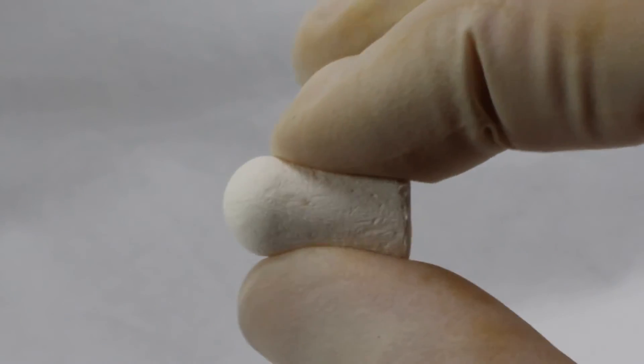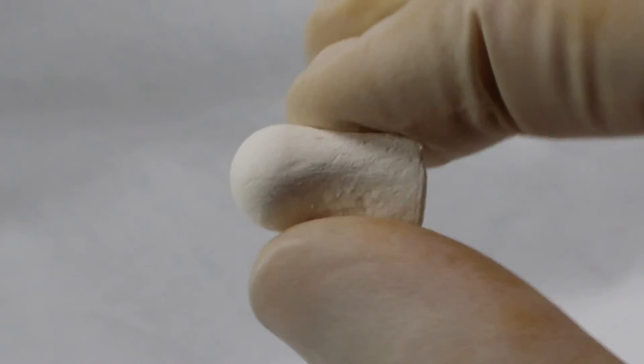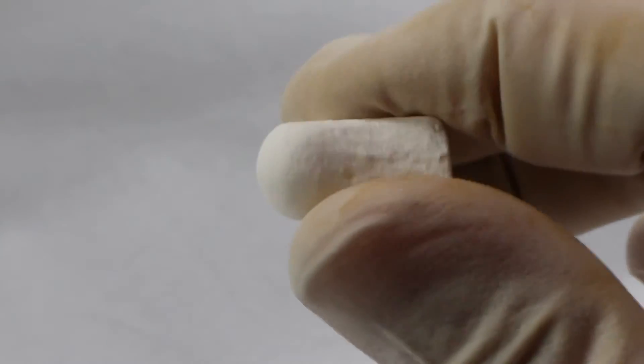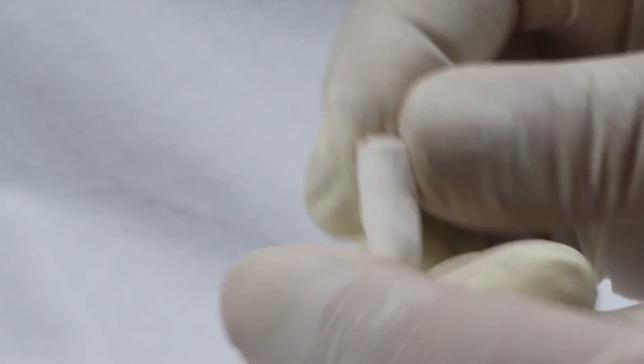As demonstrated here, the dry Osteogen Plug is firm yet remains malleable and can be shaped prior to placement. Here this clinician is rolling the plug in order to taper it apically to mimic the shape of a tooth root.